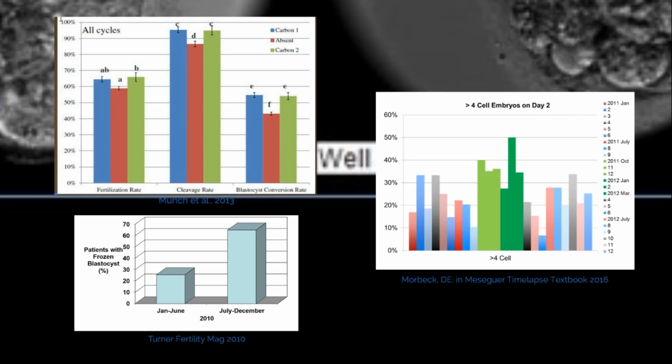And hopefully, in the perfect world, had I been able to follow it that way, I would have looked and seen that we changed a protein lot at the beginning of October, and then I could have really proven potentially that this shift occurred because of that, by changing to another lot of protein. But that's the idea behind the whole use of KPIs for tracking quality in your system.